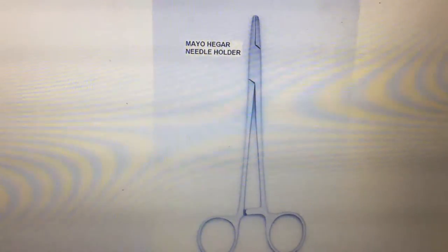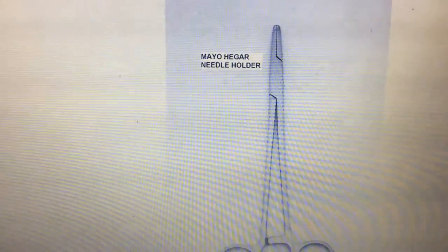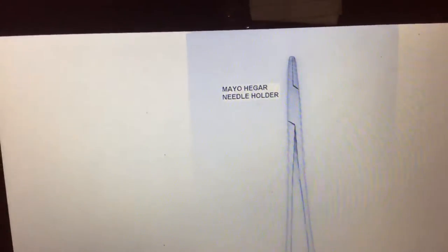Next, this one is the Mayo-Hegar needle holder. A needle holder is used to hold the needle when we are suturing a wound. The peculiarity of the needle holder is its jaw — it has a very thick, heavy jaw, and that is how we can identify the needle holder from other forceps.